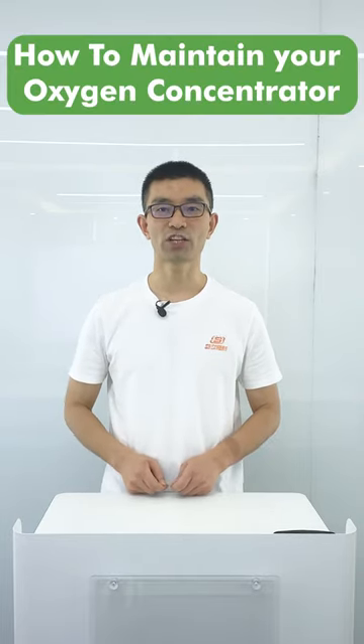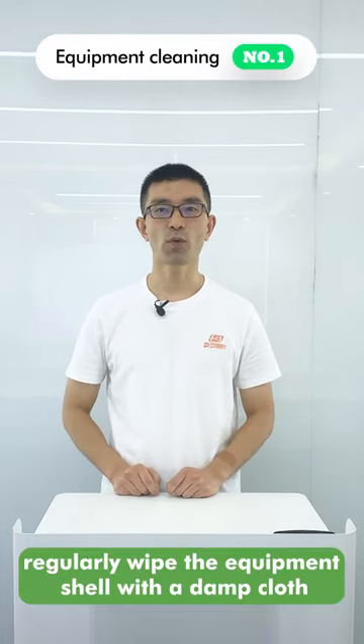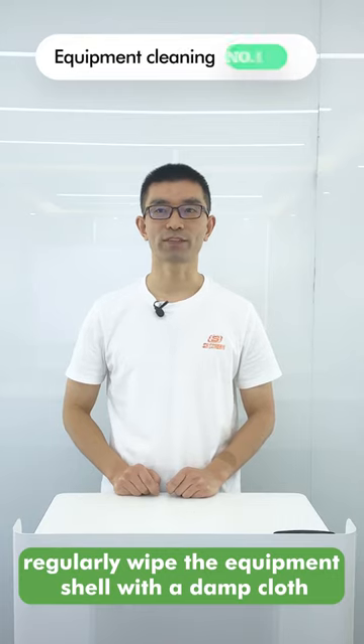Three tips to help you know how to maintain your oxygen concentrator. Tip 1: Equipment cleaning. Regularly wipe the equipment shell with a damp cloth.